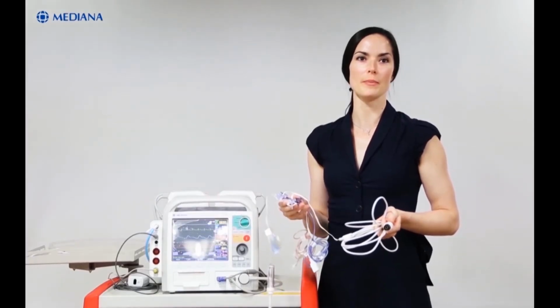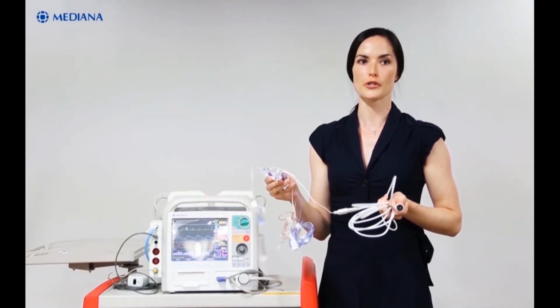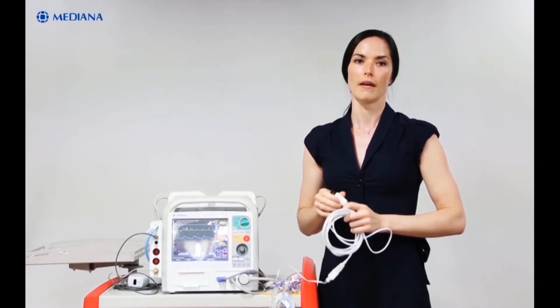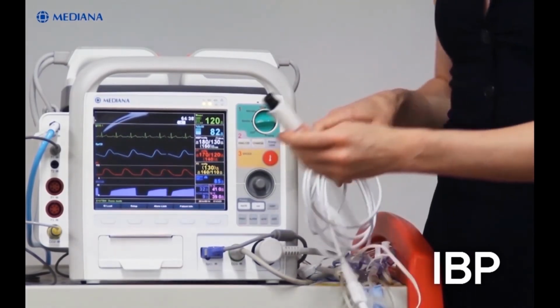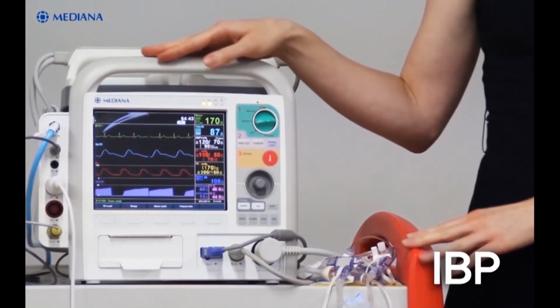Finally, for the IBP measurement, IBP transducers are needed. First, you can connect the interface cable for the transducers to the IBP connector on D500's side option case. An interface cable for the transducer has to be selected correctly, as it depends on the transducer type. And then finally, set up the patient circuit according to the directions for use of the transducer monitoring kit and IV set.